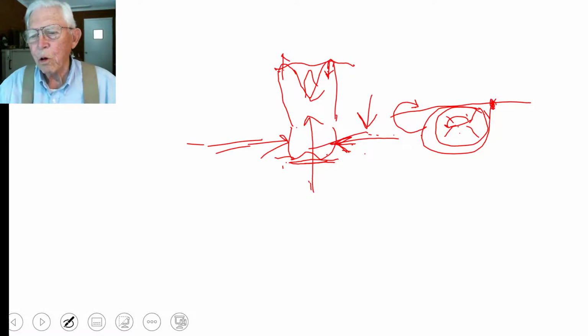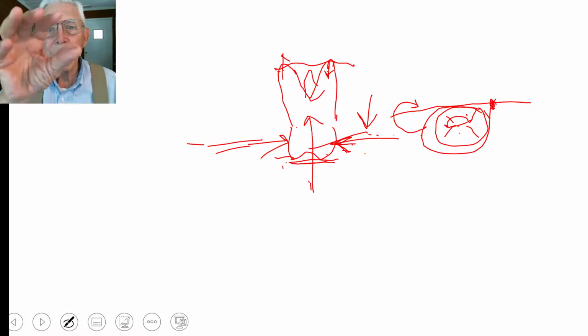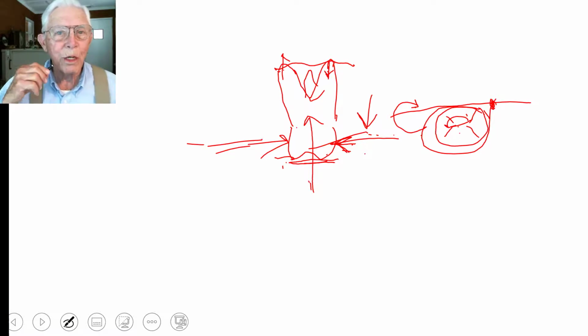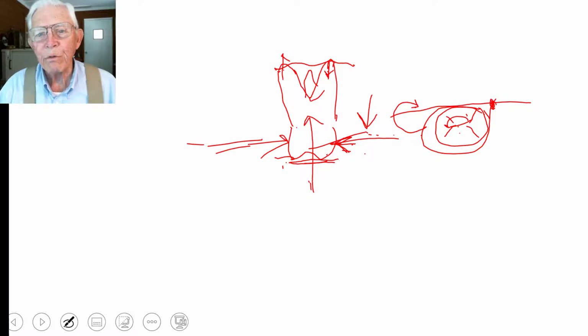That tooth will not turn and go up, and it doesn't turn and stay in the same position, but it turns and will move toward the incisal edge of it. In other words, the upper tooth, it'll go down, lower tooth, it'll go up, and if it goes either way, you're going to increase this dimension of that person's face.